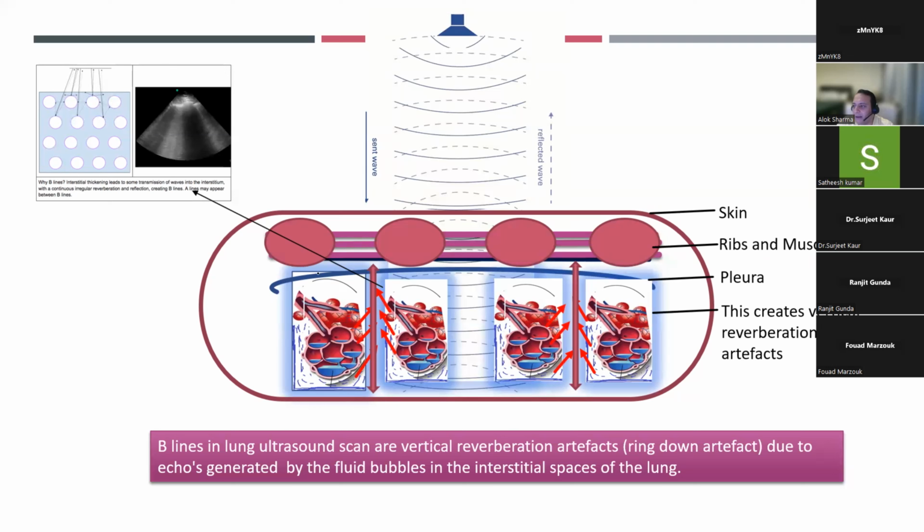And rather than horizontal lines, the shaking is going to be vertical. If I say to you that there are multiple bubbles over here, all as tetrahedrons, it's shaking along this entire column. This is the theory behind how B lines are created. I would like you all to read the article that I sent to you by Patricia Wood. It's very good and gives a very nice explanation of how that happens. But we'll cover it again, so don't worry.